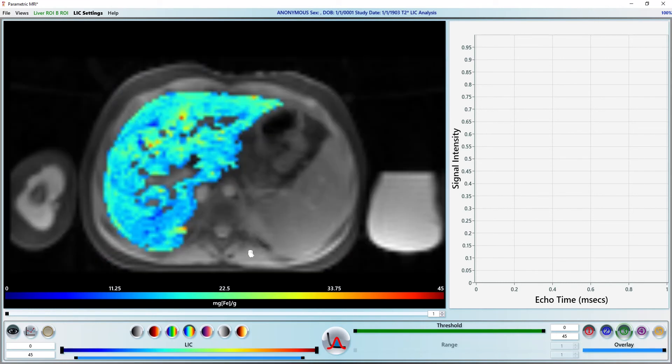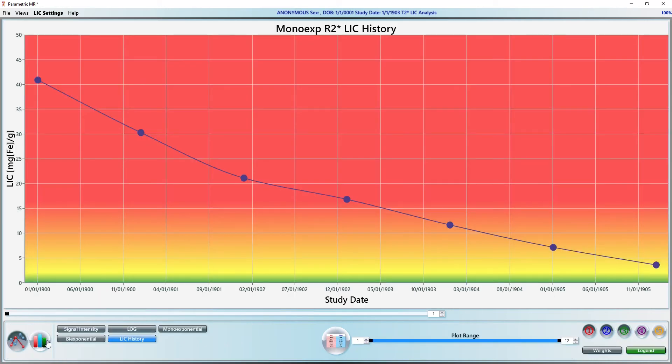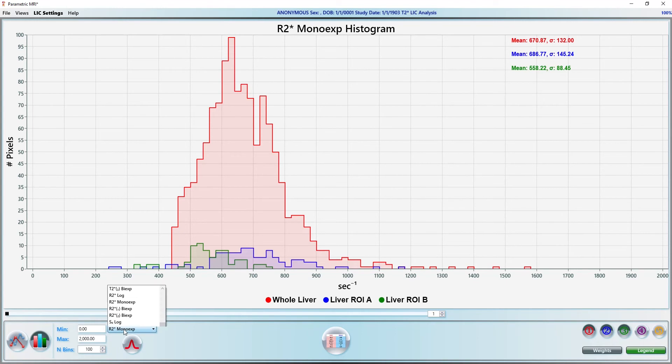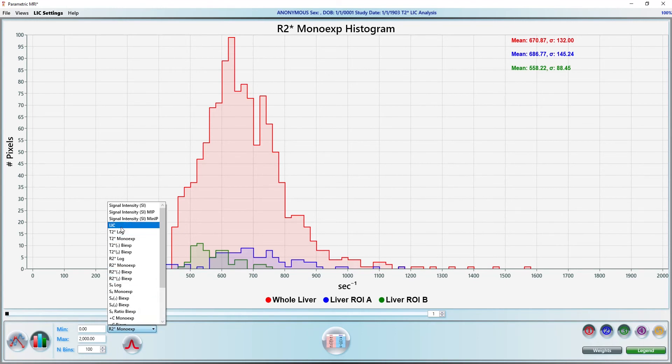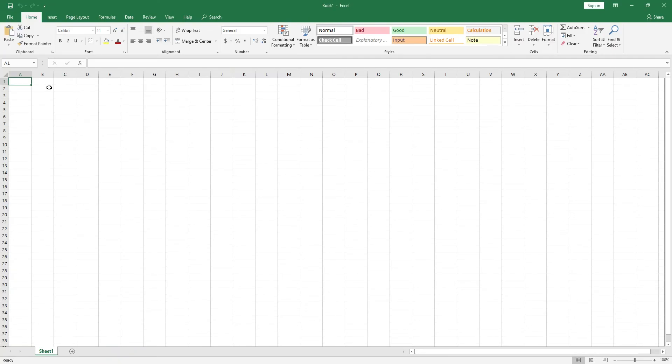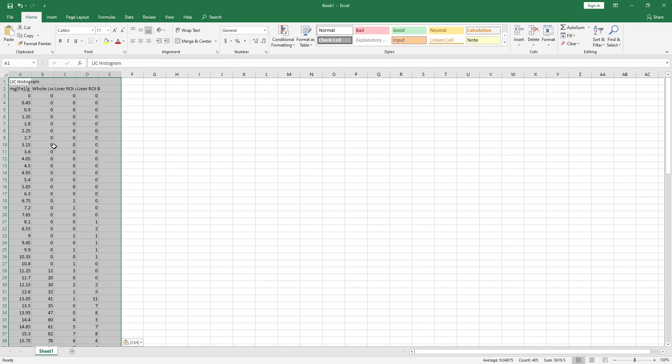Finally, let's go back to the plots page and switch to histogram view. Select LIC from the drop list to display an LIC histogram. As with any plots in PMRI, pressing CTRL-C will copy the plot data to the clipboard. This is a convenient way to export data into Excel for further analysis.